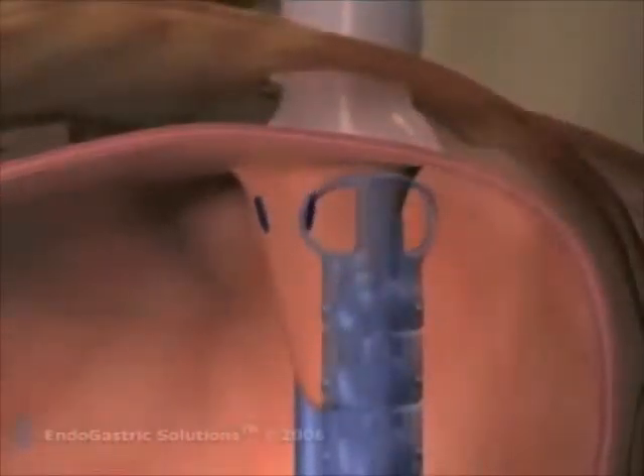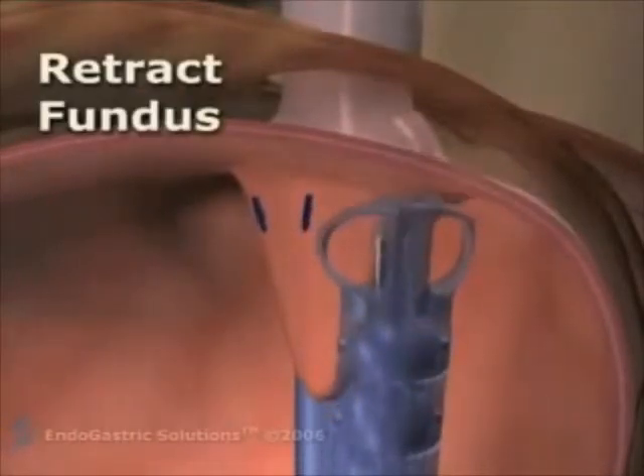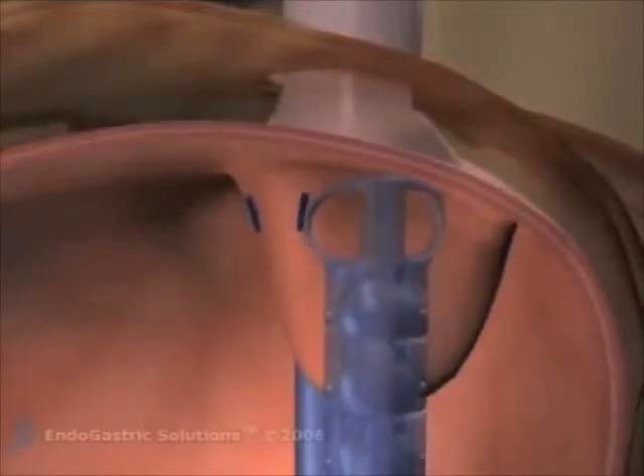The esophagus device is repositioned by rotating the instrument and a new pair of fasteners is deployed. The operators repeat this process until they are satisfied that a 270-degree flap valve is created.